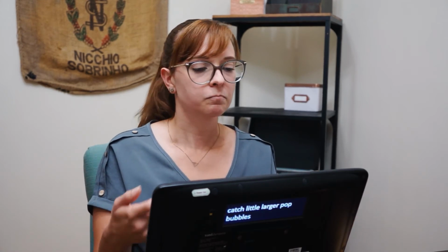Okay. And so you're clicking on the buttons. You're just incorporating the buttons into the language that you would probably use in regular narration when doing the activity anyway. And as with modeling, initially you are going to be touching the buttons and being the one using the buttons the most. But after a couple minutes of that, you kind of want to step back and let your individual have a chance to activate the buttons.